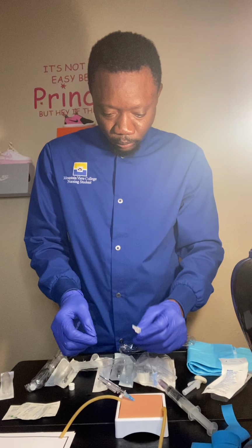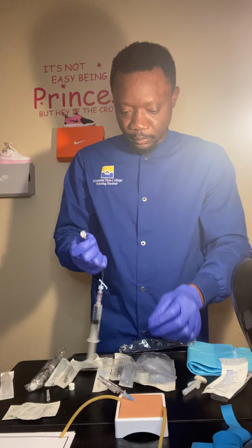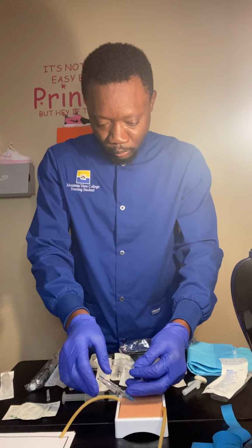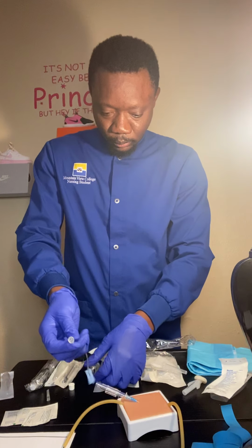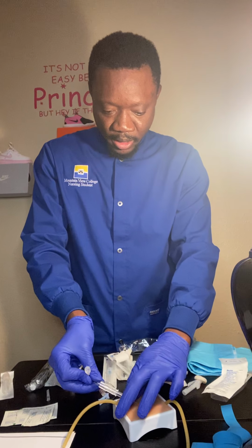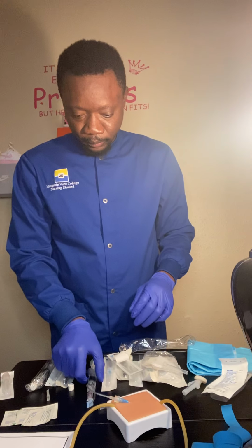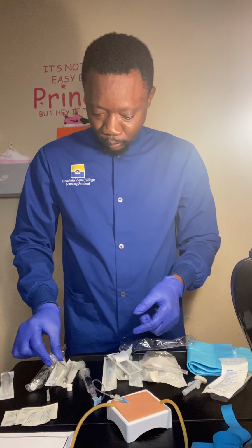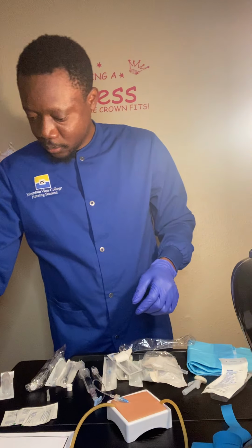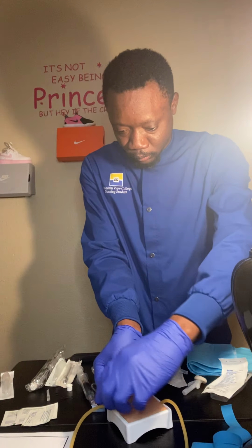So I untwist it, getting it ready. And then holding the blue pad. Okay, now my IV is secure. Okay, so I'll go ahead and with my skinny tape, I'll do a butterfly to secure my line.